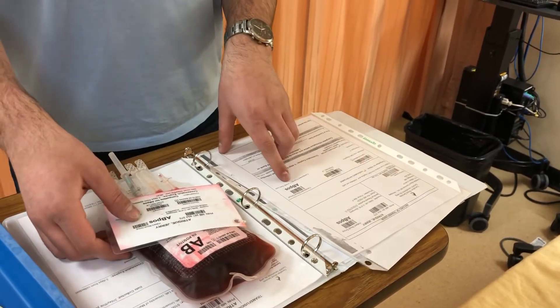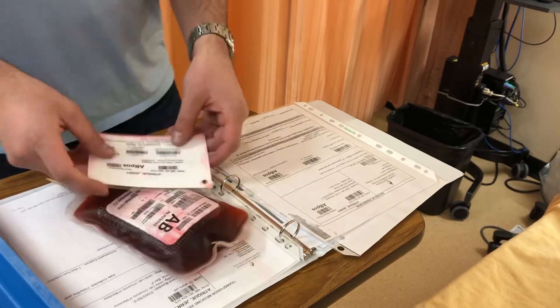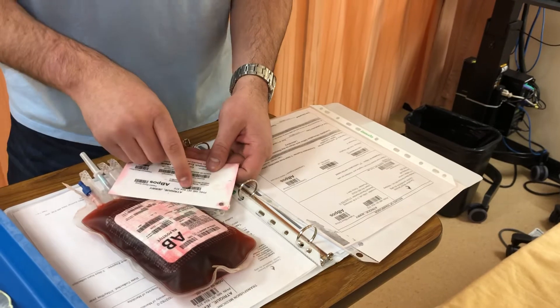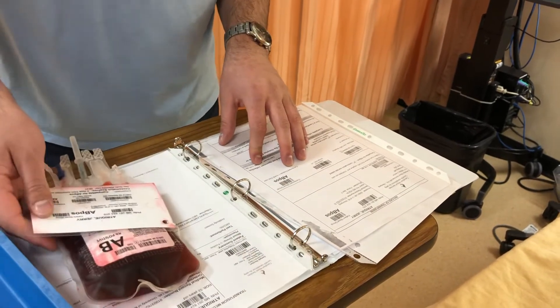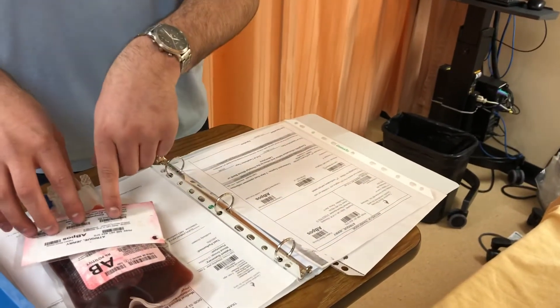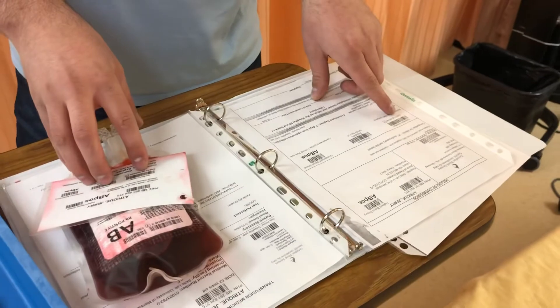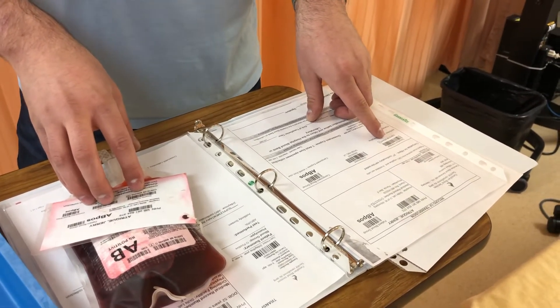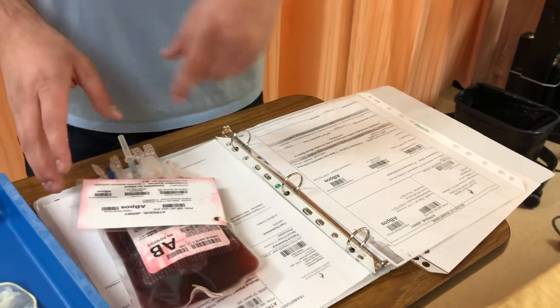The component isn't expired. Now I can compare the blood tag to the blood bag. On my last check, I realized I forgot the donation number, so I'll make sure to check that as well. Donation number: C0-510-0808-900-445 — boxed Y — confirmed by both nurses.